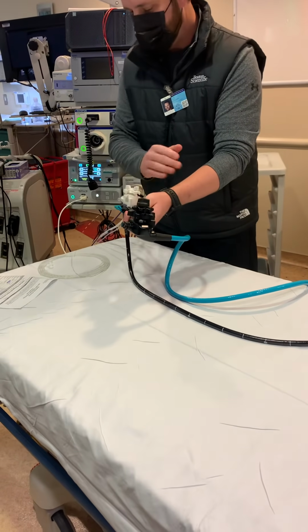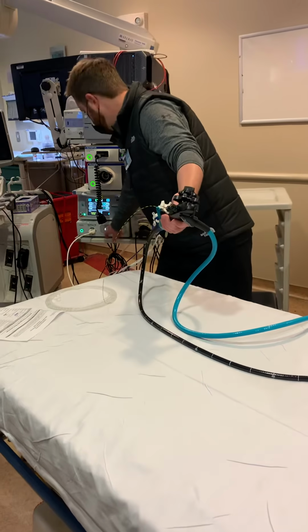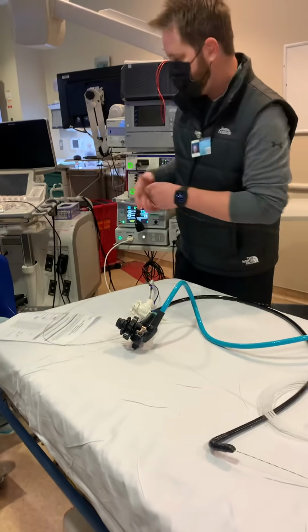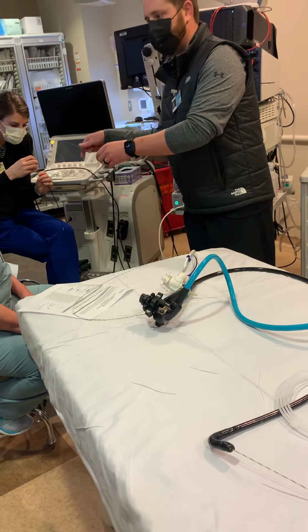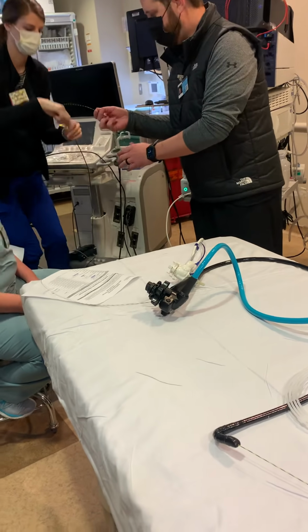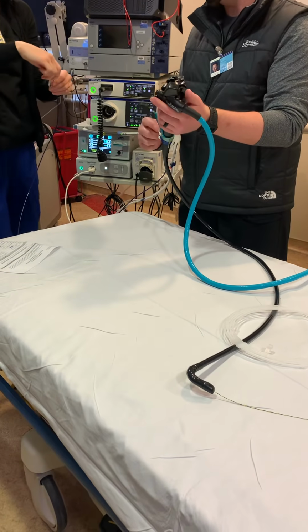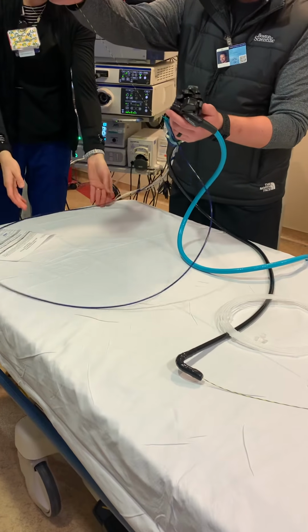All right, our dials are in line. We have irrigation and suction connected. We know we're getting an image on the screen. Our light's off currently. And then all Connor has to do is load the guide wire into the largest hole in the tip of Spy. She's going to feed that in. As that feeds in, we're waiting for the wire to come out the biopsy port of Spyglass. So our wire just came out, and now I can slide it by pulling here the rest of the way.